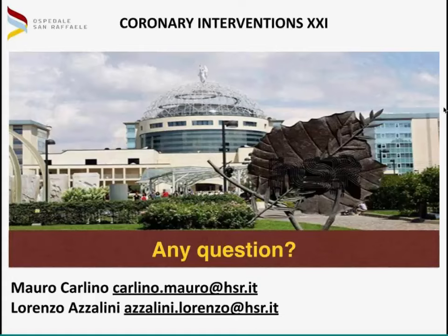Sure. And then do you ever use IVUS to guide this, or is it completely IVUS independent using the DRAFT? There is no reason to perform IVUS unless you have to perform IVUS for other reasons, not for the success of this procedure, because it's very difficult performing IVUS at the same time I create a fenestration and at the same time I have to cross this fenestration. So it's just to visualize all the information in order to get the wire inside the guiding.